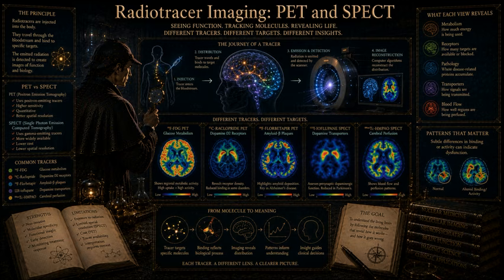Let me see if I have the concept of back projection right. I have a specific line of response going from the front of the head to the back, and the scanner says, exactly 100 coincidence events happen somewhere on this line. Yeah. Pure back projection essentially takes the number 100 and smears it evenly across every single 3D pixel, every voxel along that entire line. Conceptually, that is exactly what it does. It assumes the radioactivity is spread evenly across the path.